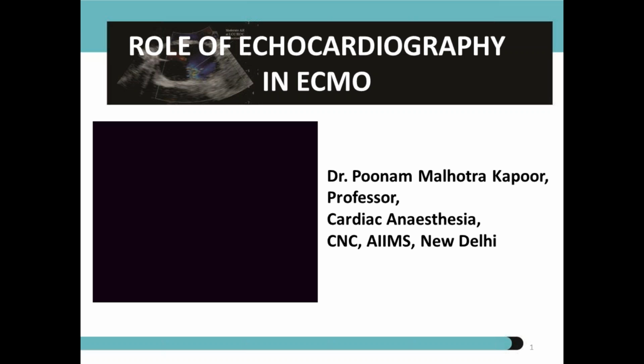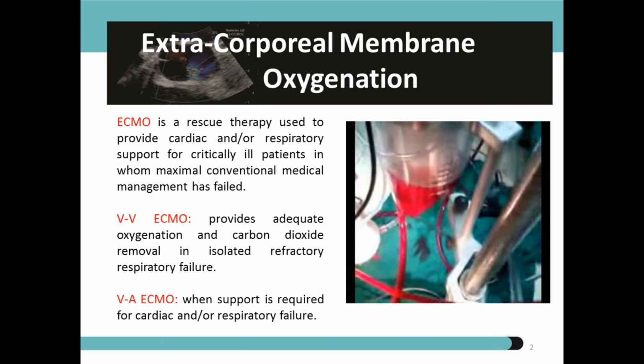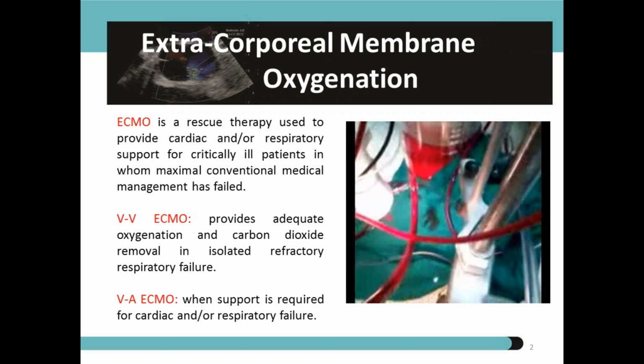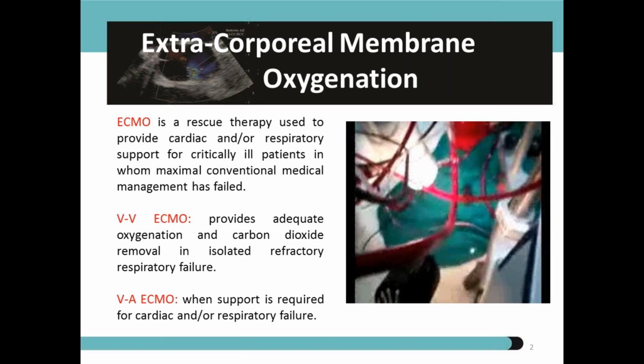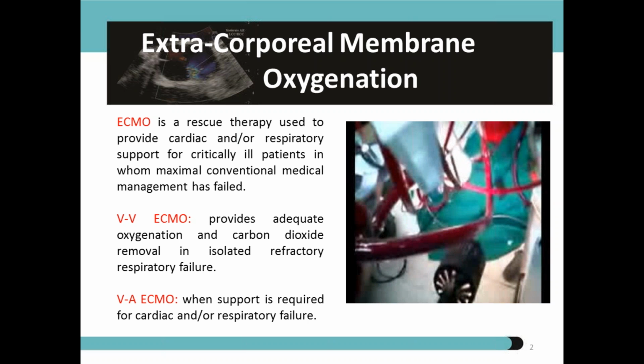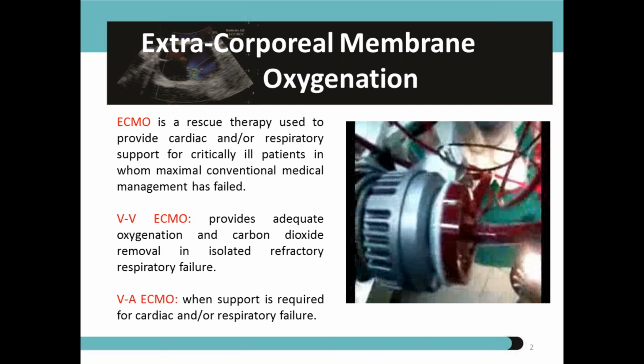And while we were doing so, the concept of ECHO in ECMO came up. And it's a very novel concept. While you are on ECMO, you use so many cannulas. This is the 2001 picture I have of a video. It started in my theater, and I'm very proud of it when we did our first ECMO at AIIMS.